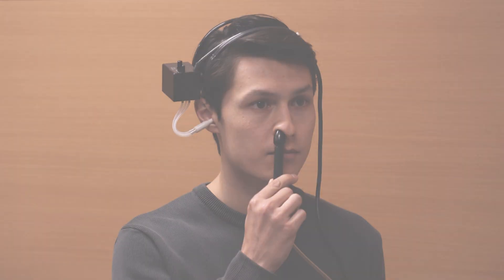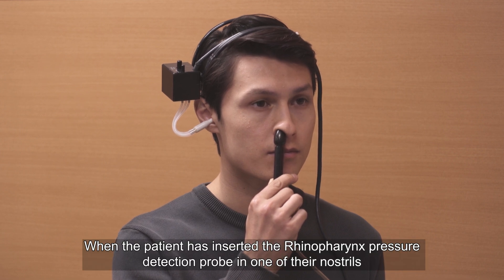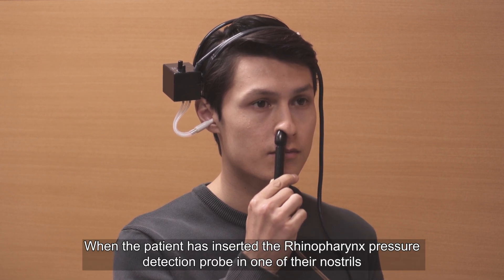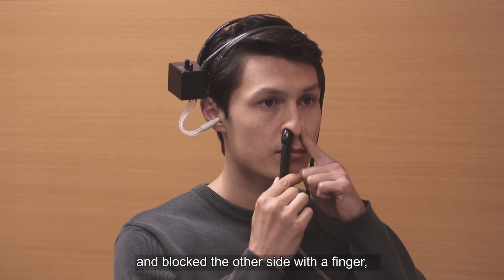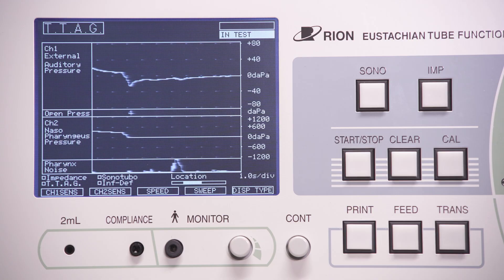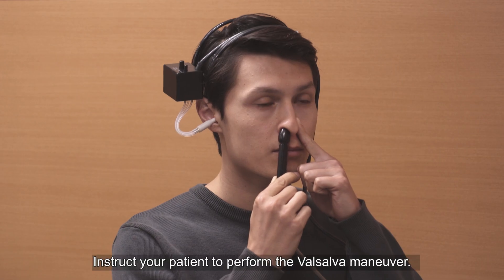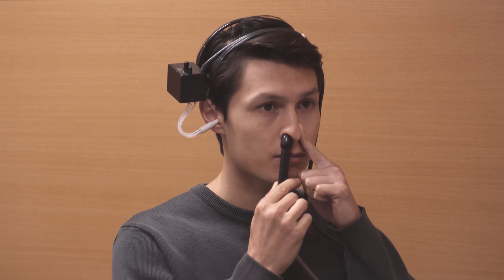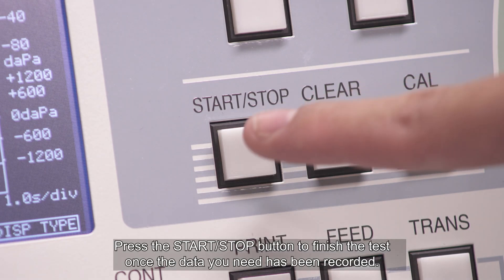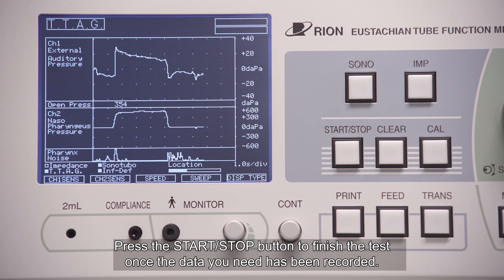This section will demonstrate the full test procedure. When the patient has inserted the rhinopharynx pressure detection probe into one of their nostrils and blocked the other side with a finger, push the start/stop button. The test screen will begin to scroll to the left. Instruct your patient to perform the Valsalva manoeuvre. Press the start/stop button to finish the test once the data you need has been recorded.